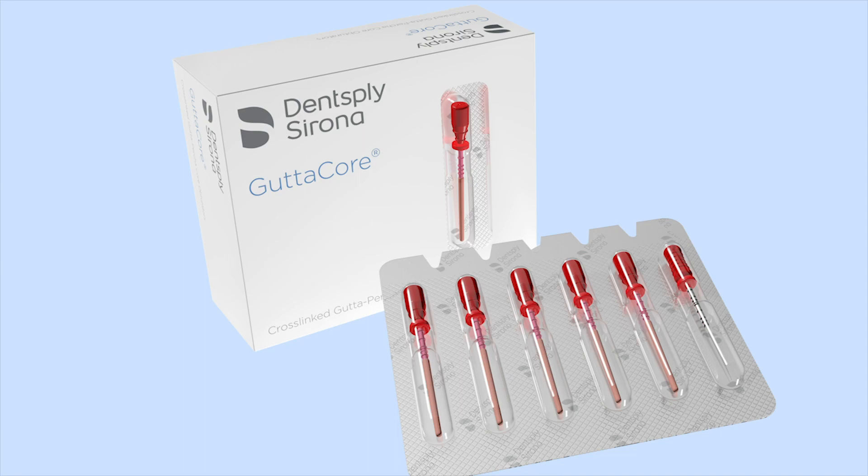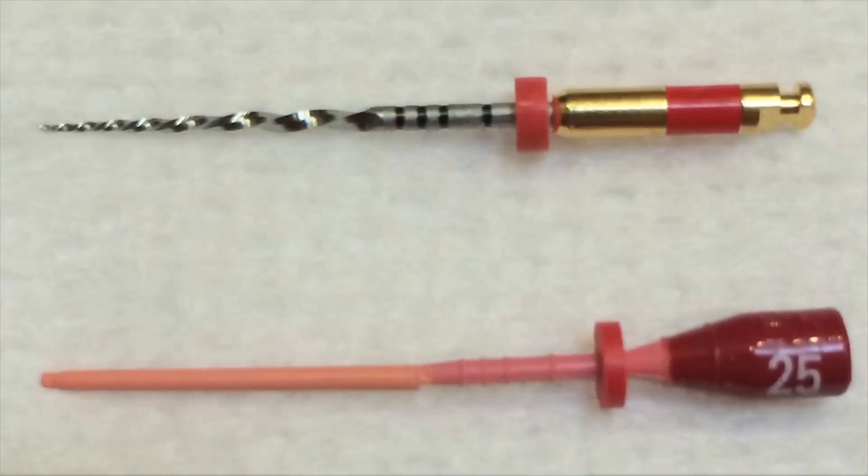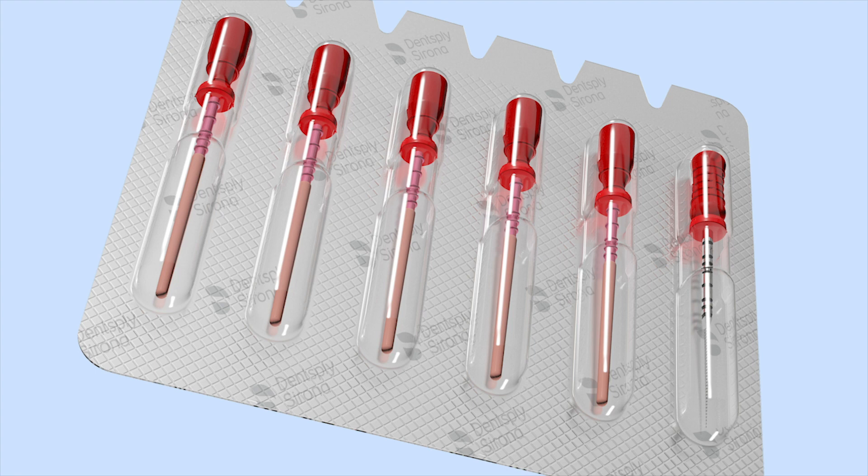First, you need to select the Gutta Core that corresponds with the master motorized NiTi file you used. It's very simple — just match the color of your master file with the color of the Gutta Core. Next, you need to select the corresponding size verifier NiTi hand file. The size verifier is provided with your Gutta Core obturator packs. This too is color coordinated, so if your master file was red, you use a red size verifier.